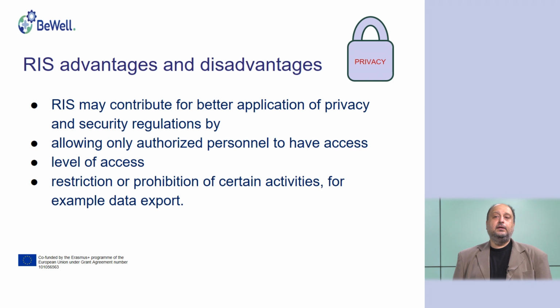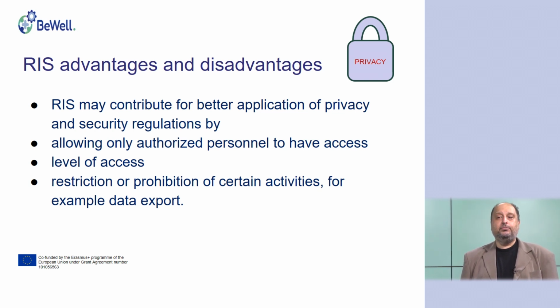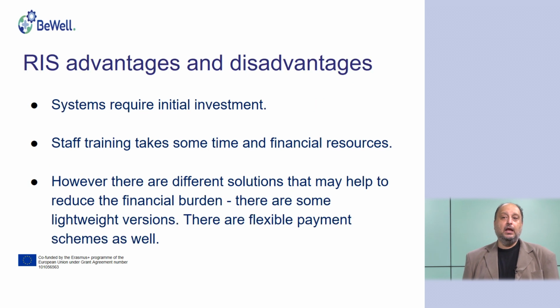And as mentioned, the radiology information system may contribute to the application of privacy and security regulations by providing access only to authorized personnel with a given level of access. And you may restrict or prohibit some activities, for example, data export.